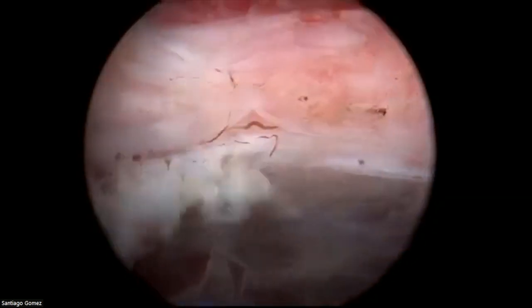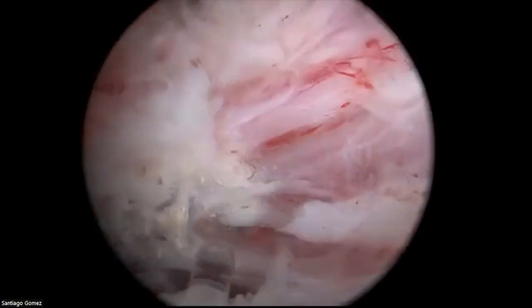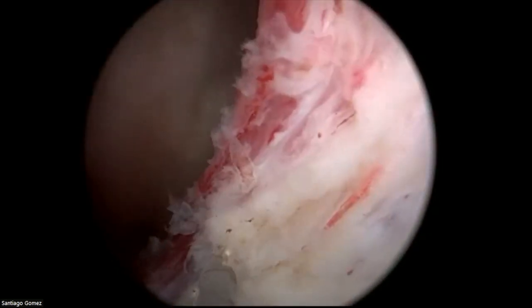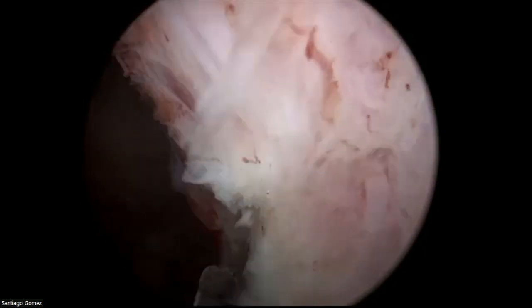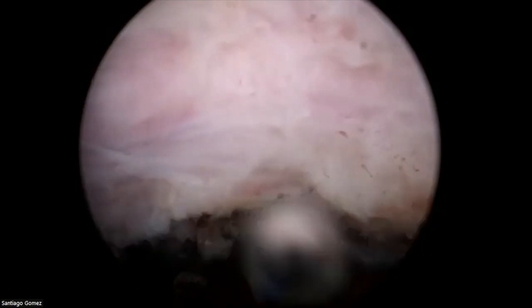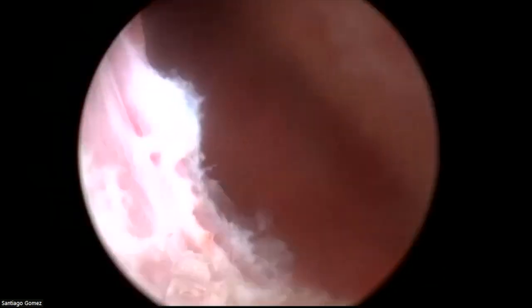Okay, so let's check the final hemostasis. Especially, it's important to check near the bladder neck, because this explosive nature of HoLEP is a disadvantage here. You see, when you cut the mucosa, it's an explosive cutting property. So sometimes there's disruption of these vessels and there's a tendency to bleed from the mucosal edge.